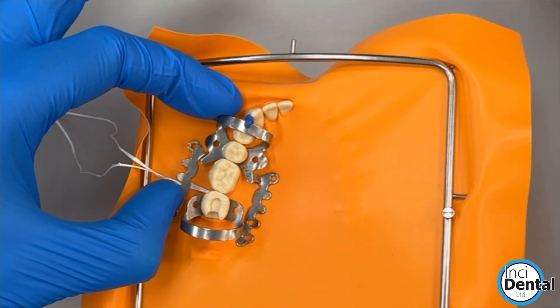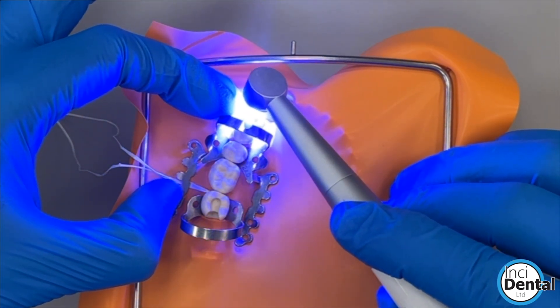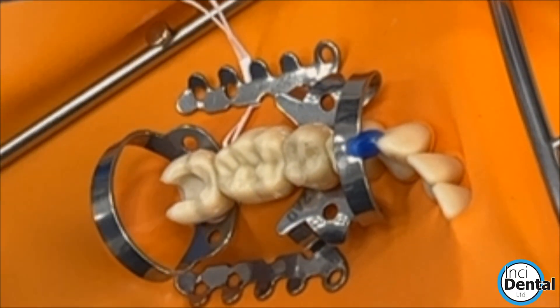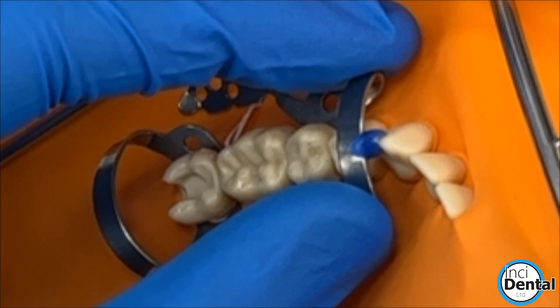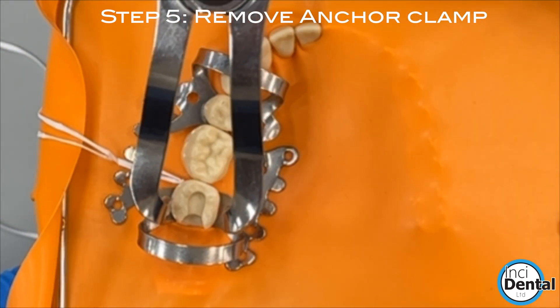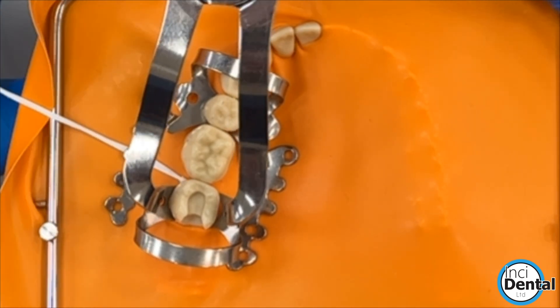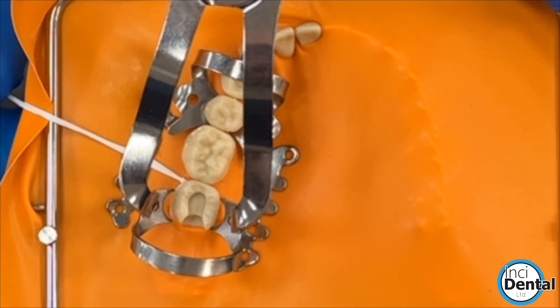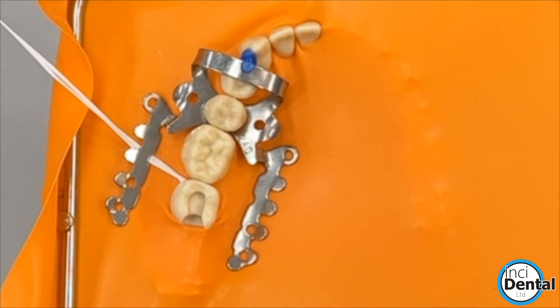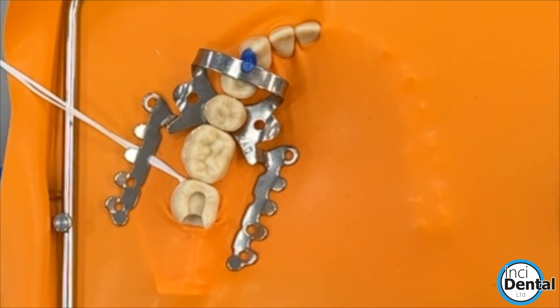Place a liquid dam stop at the front. Once you're in this position, you can simply take off the last tooth. And you now have all the room in the world to do your matricing.